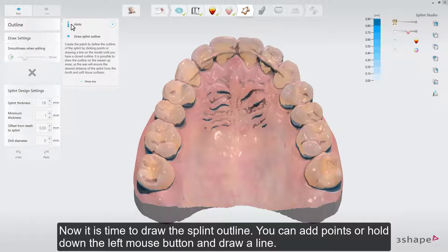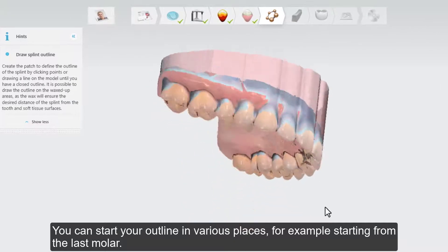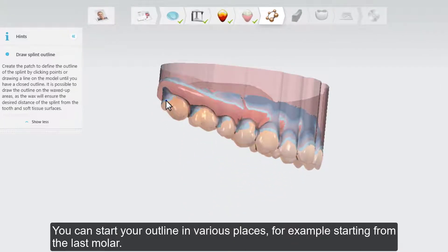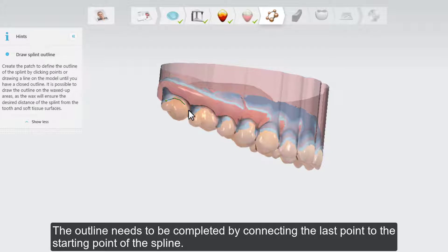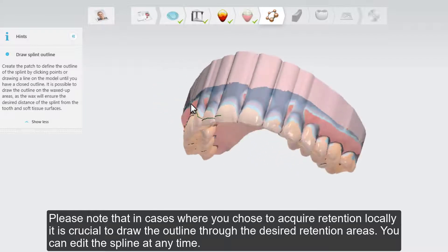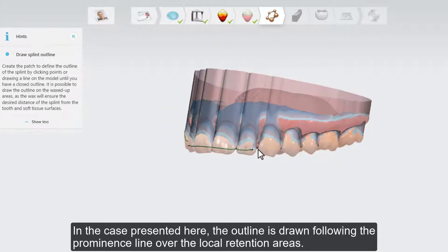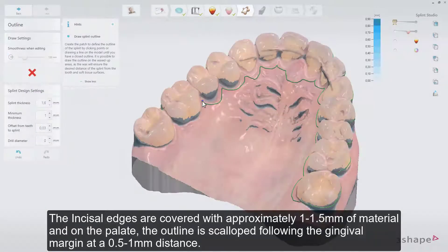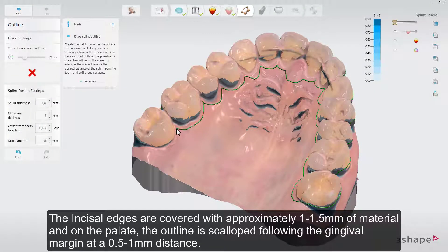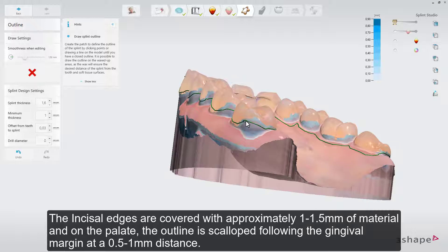Now it is time to draw the splint outline. You can add points, or hold down the left mouse button and draw a line. You can start your outline in various places, for example starting from the last molar. The outline needs to be completed by connecting the last point to the starting point of the spline. Please note that in cases where you chose to acquire retention locally, it is crucial to draw the outline through the desired retention areas. You can edit the spline at any time. The outline is drawn following the prominence line over the local retention areas. The incisal edges are covered with approximately 1 to 1.5 mm of material, and on the palate the outline is scalloped following the gingival margin at a 0.5 to 1 mm distance.